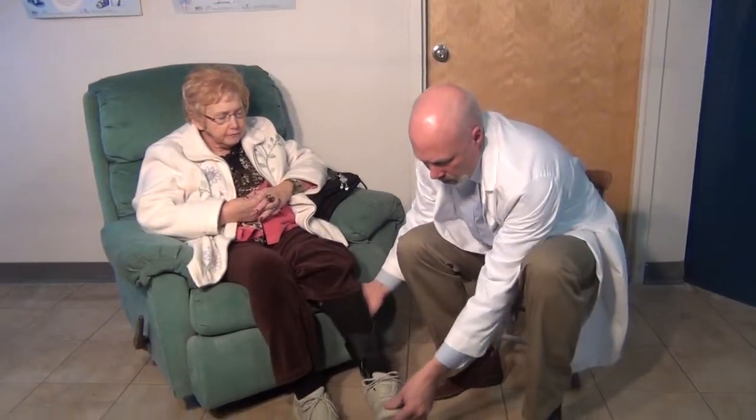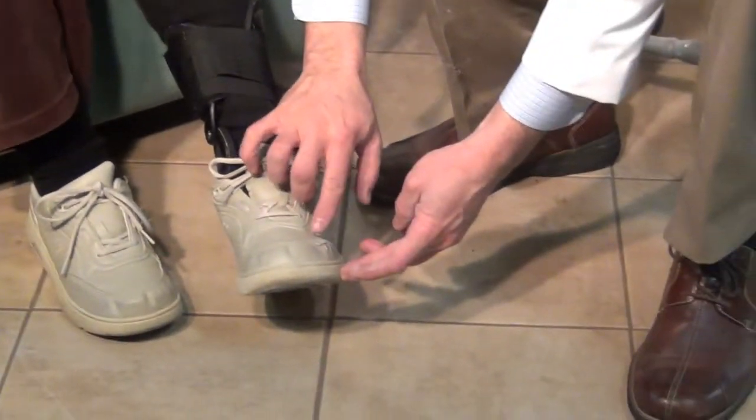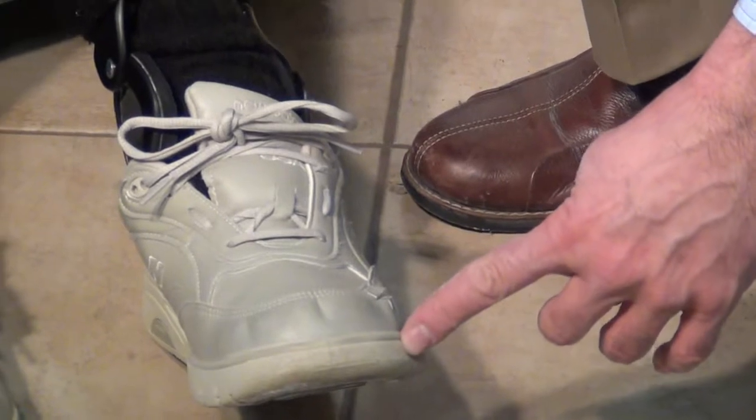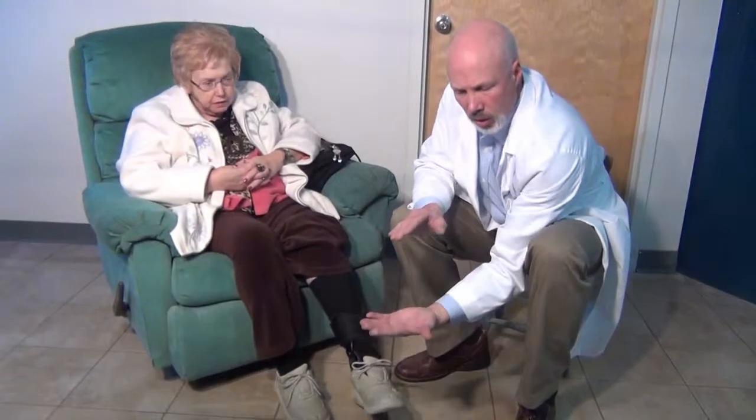She's got a Blaze MI design which is working pretty well, except she's got some toe problems — hammer toes on the left side — and that hammer toe is creating a problem. What we did here is we relieved the top part by cutting a little bit into the shoe, and that's solved the problem on the dorsum of the toe. But she still has a hammer toe problem at the very end of the toe where the toe drives down into the shoe.